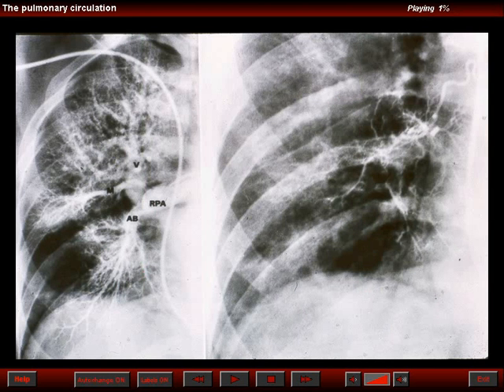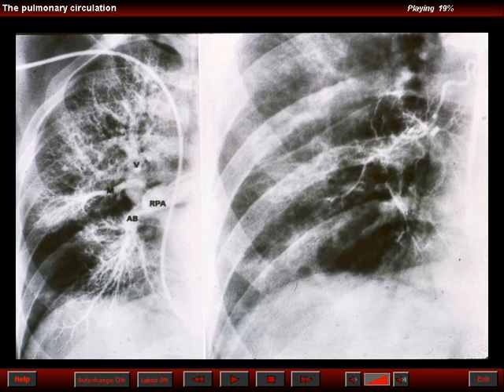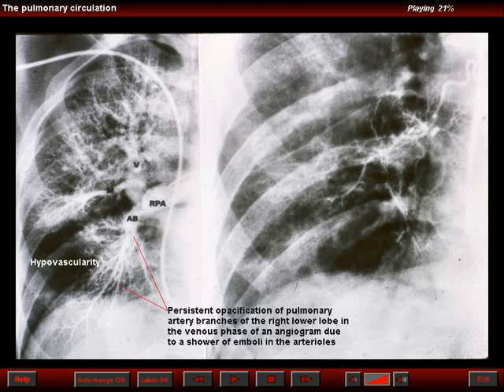Pulmonary emboli can involve the central pulmonary arteries as well as the peripheral arteries. To your left is a pulmonary angiogram of a patient who had regional oligemia affecting the lower part of the right lung. Note that we are in the venous phase of the pulmonary artery injection, and we still see persistent arterial filling in the middle lobe and in a segmental portion of the right lower lobe. This is indicative of a shower of emboli at that level — small vessels, the size of an arteriole or slightly larger.